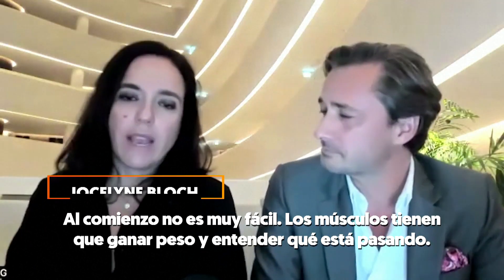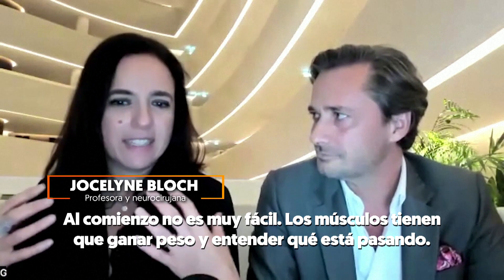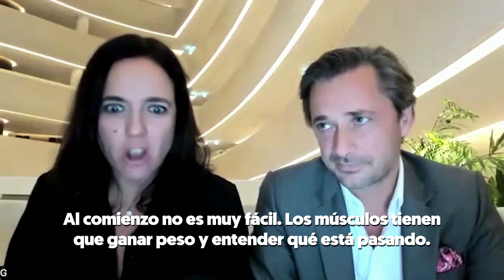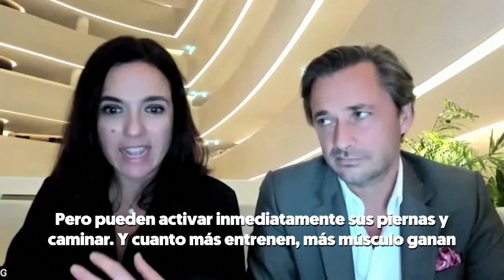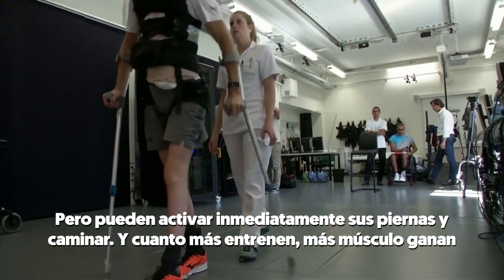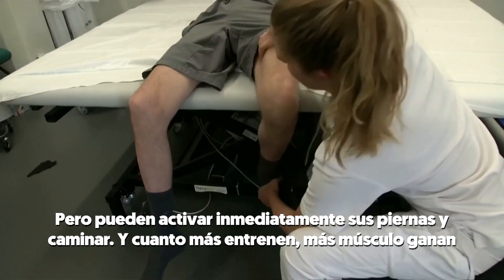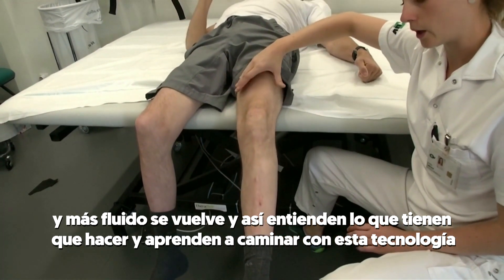At the very beginning it's not super easy. They still need weight bearing and they need to understand what's going on. But they can activate immediately their legs and step. And the more they train, the more they start building muscles and the more fluid it becomes. They understand what they have to do and they learn to work with this technology.